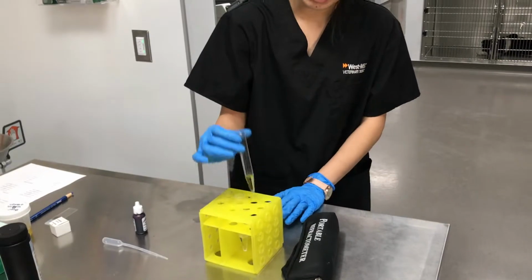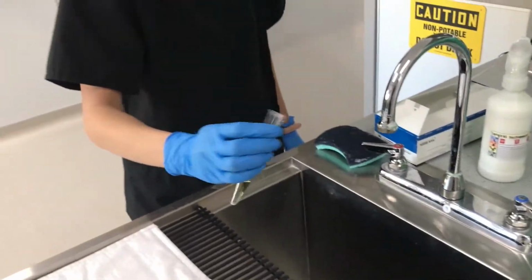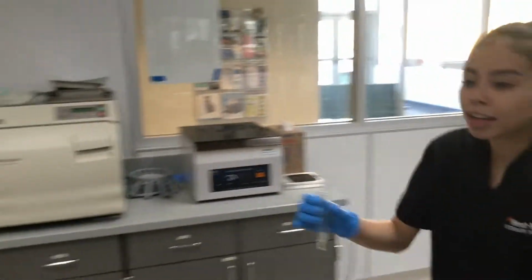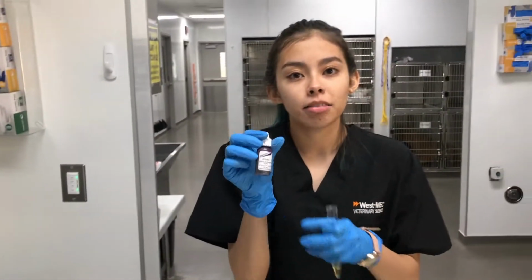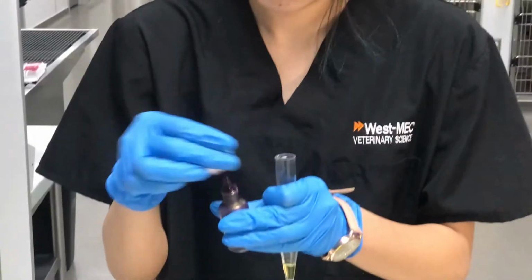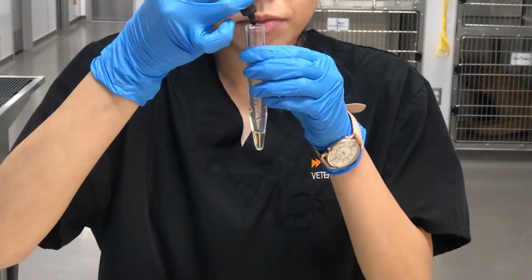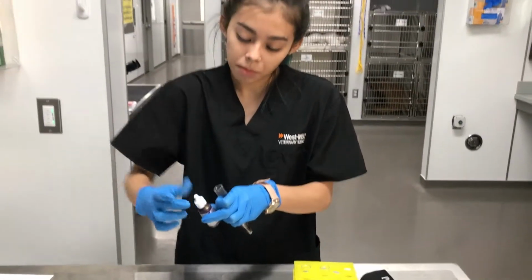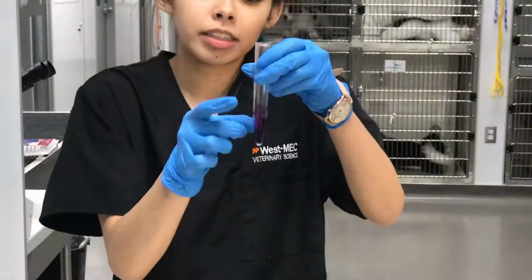So coming back over, the next step will be to decant the urine sample. So I'm going to come over to the sink, and I will do a quick motion. Okay, so once I'm done with this, I'm going to come back here, and I'm going to add the urine sediment stain into my urine sample. So all I need is one drop. Okay, so I'm going to close this back. So I'll kind of flick this so it can mix in there.